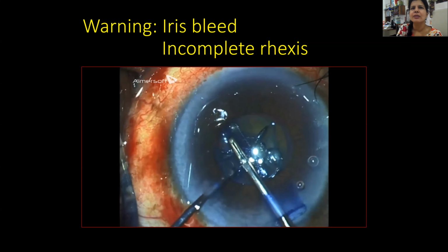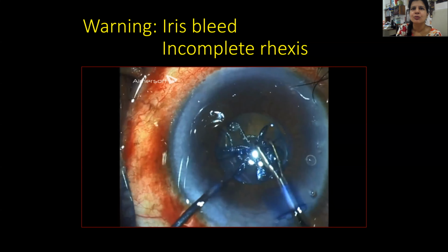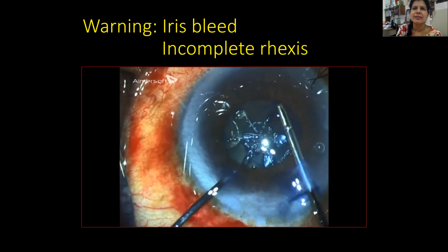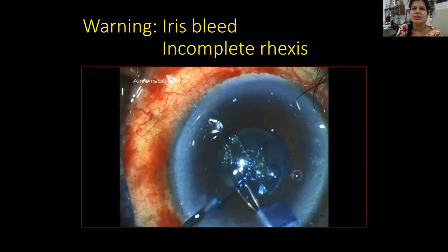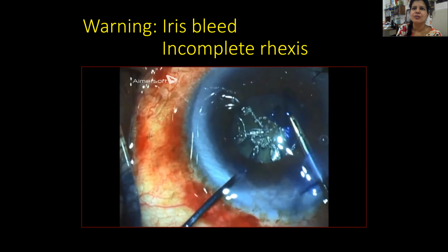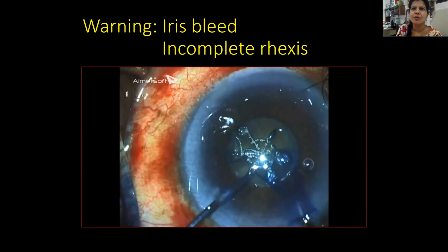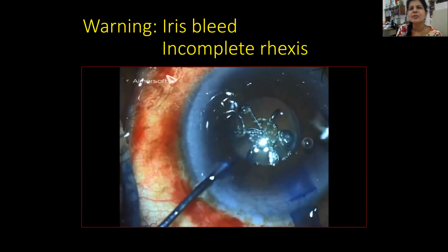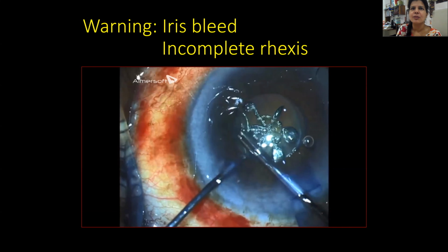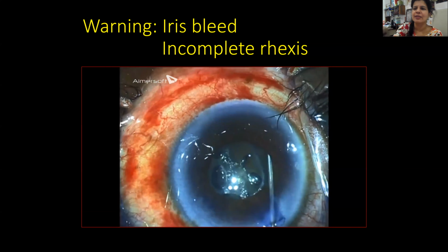There could also be a capsular adherence in the region because the laser was never able to penetrate through the iris to the capsule. Now here we have a tag at that end, and we also see that the capsule is attached to the rest of the anterior lens capsule at the inferior margin of the iris as well. So all these attachments need to be gently cleared off before drawing the capsule out. Now, whatever tag is left in the region of the 10 o'clock position has to be gently peeled off so that later on it does not extend to become a posterior capsular rent.